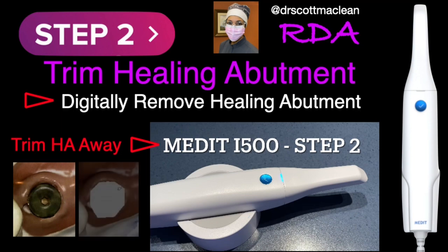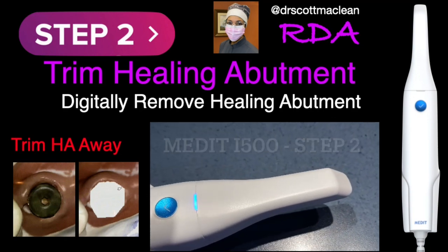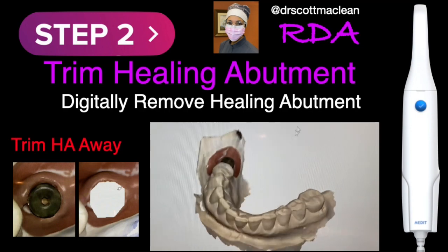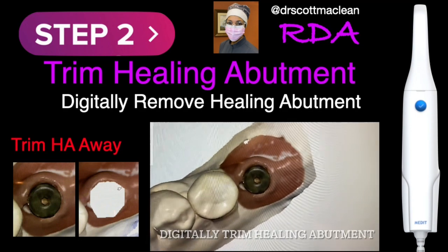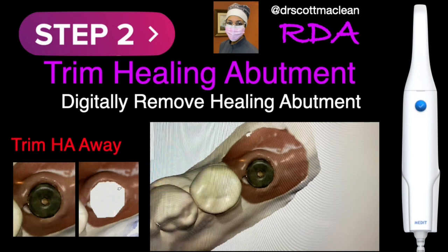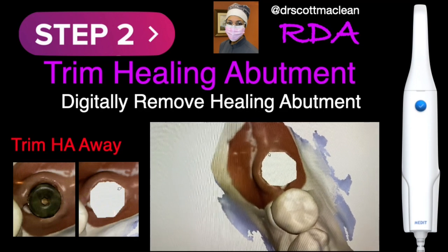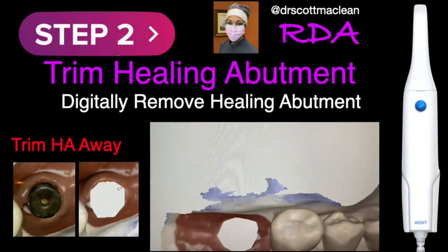But this is still on the initial scan that you're going to take, but you're going to take the healing abutment and digitally remove it. So as you remove it, you're going to see that the scan is then ready for the dentist to come in and do their work. And so we want to do this because we don't want the tissue to slump. And now that all the rest of the scan has been taken, we can move from that part of the scan over this area of the soft tissue very quickly, which brings you into step 3.